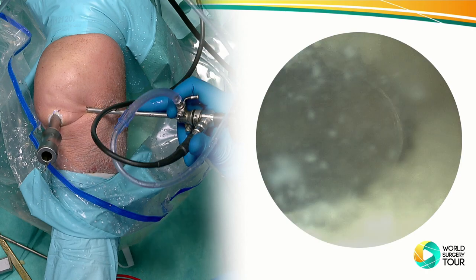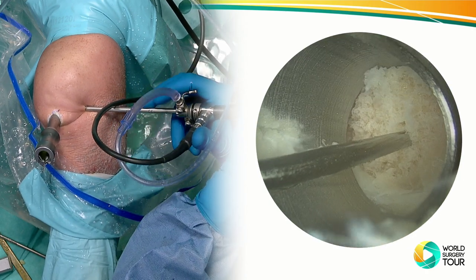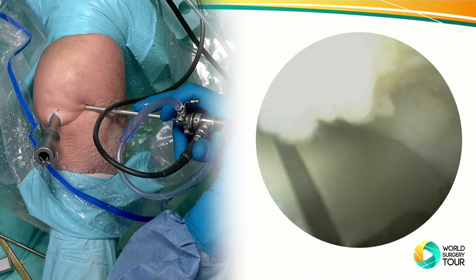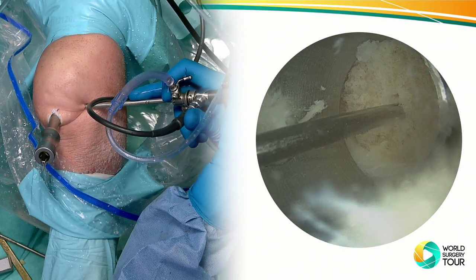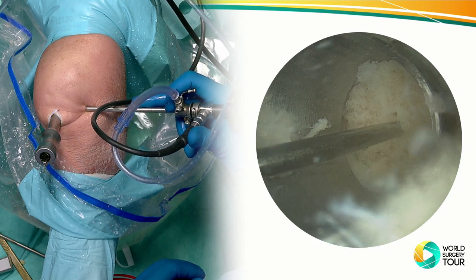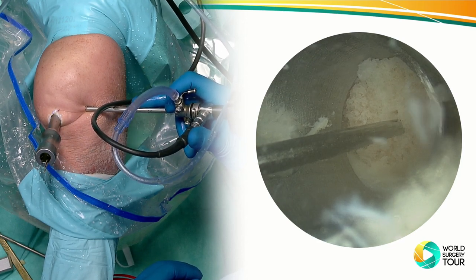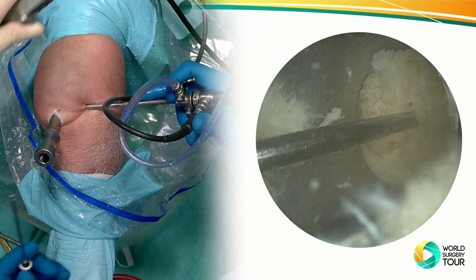But you can see the defect is perfectly cleaned up already. And now, as soon as the water is not in the joint any longer, we can insert the membrane in the next step. The membrane is already prepared and looks nice so far. Try again? Good. Okay, that's the new shaver blade. Please put it on there.